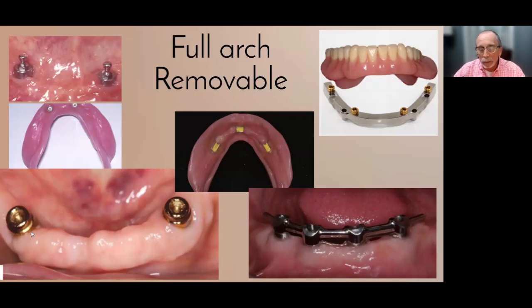And again, the most common edentulous implant restoration out there is that two locator overdenture. Very economical, very minimal space required, and very successful. So that's why it's the most common. It does work. I think there are specific patients and treatment plans that call for this, and it will always have a place.